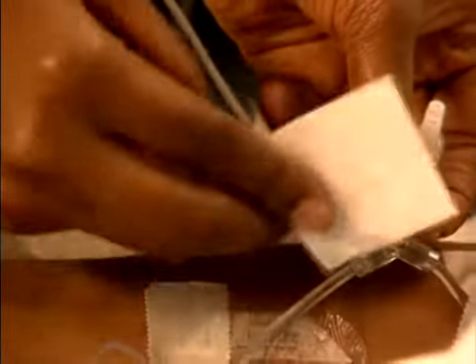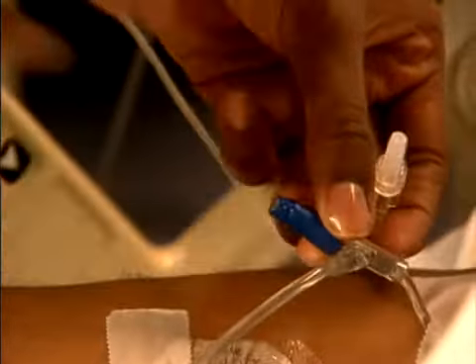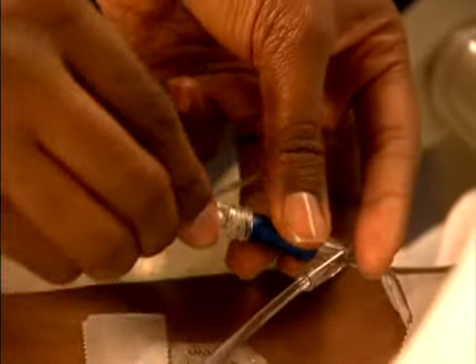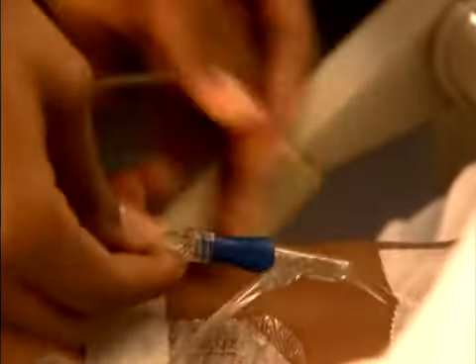Now use an alcohol swab to clean the medication administration port on the primary infusion tubing closest to the patient and connect the mini infusion tubing. With that done, I program the pump to the correct rate, in this case over half an hour, and press start.